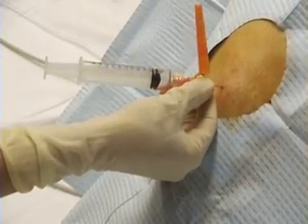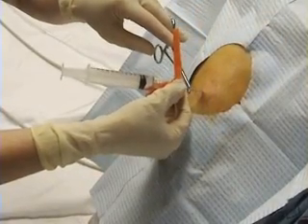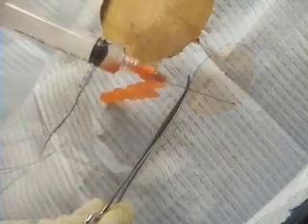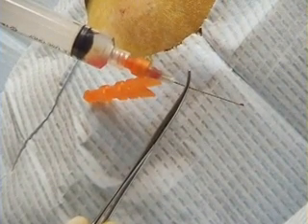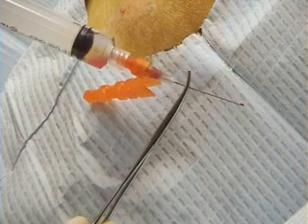Inject more anesthetic at this point to anesthetize the highly sensitive parietal pleura. Note the depth of penetration and then withdraw the needle. If available, a hemostat may be attached to the exposed portion of the needle to mark the depth of the pleural space.